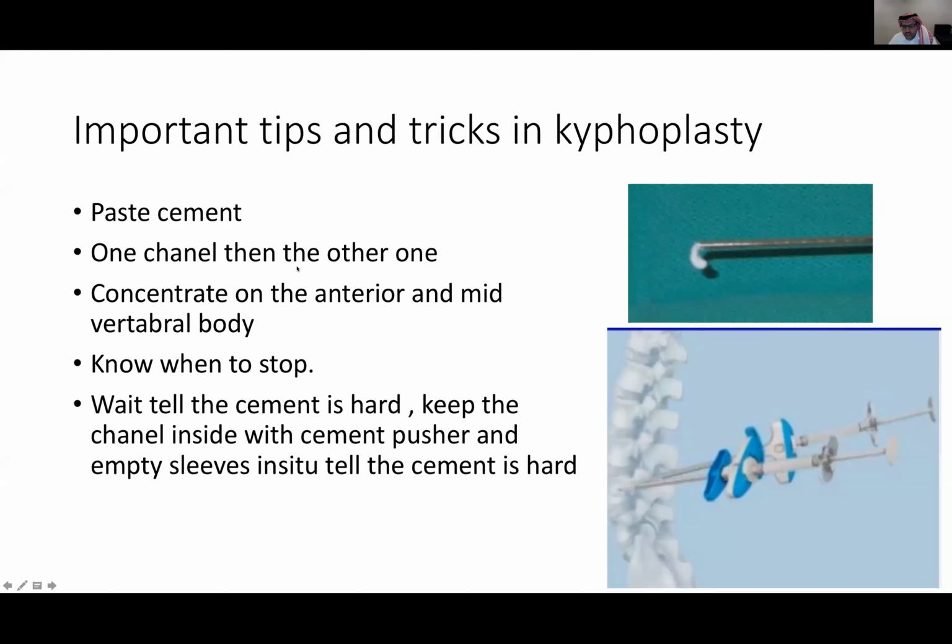If you do the procedure, it's better to do the cementing yourself, not your colleague, even if he's experienced. And why is that? Because you will take a lot of pictures and you will concentrate at the same time. You can put both of the channels, as you say here, inside, and you prepare your injecting material, then you start to inject a little bit here, a little bit here, but you are the one in control. You look at the screen and you know.